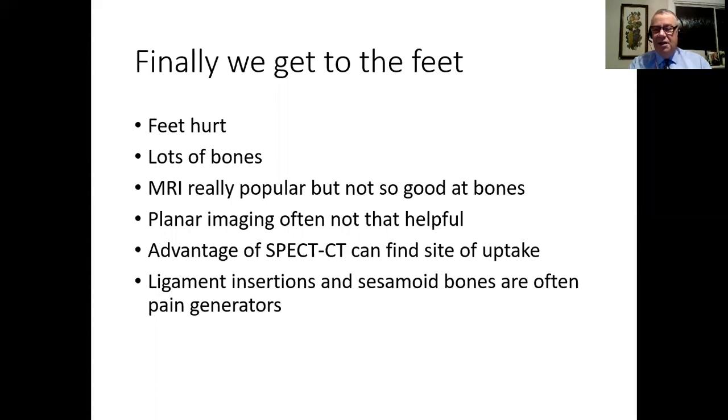Now, MR is a very popular way of looking at this, and you'll be told by MR radiologists that you only need an MR of the foot. But the point is that MR is not that helpful for 2 reasons. One is it doesn't really see bones very well. It does see bone edema, but bone edema is incredibly common.